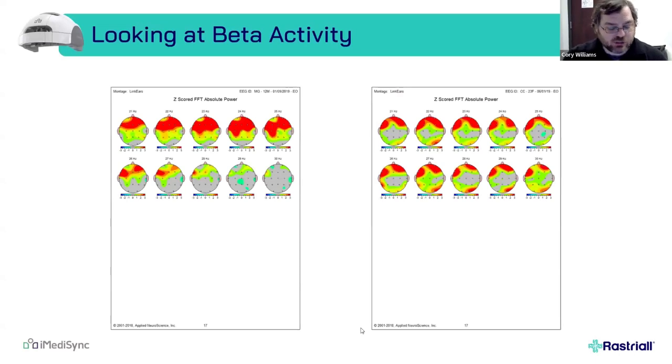And then these are 2-dimensional maps here, and I'm skipping ahead a little bit because I wanted to show you what we see is a high beta, right? This is 21 hertz to 25. This is 26 to 30. And 2 different people, 2 different clients, the maps look similar, right? These look like fast brains. 21 to 30 hertz is a fast frequency. This is a high level of activation. Okay, so they almost look identical, lots of fast stuff.